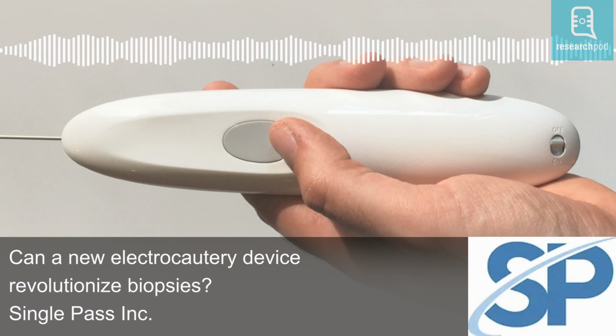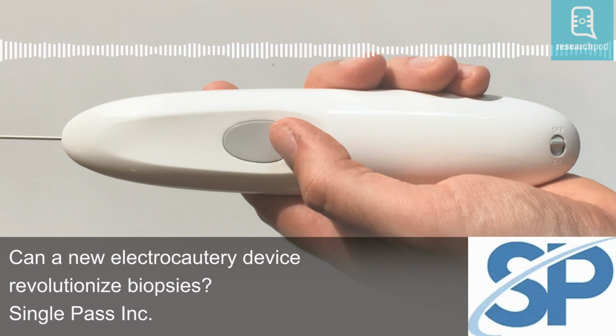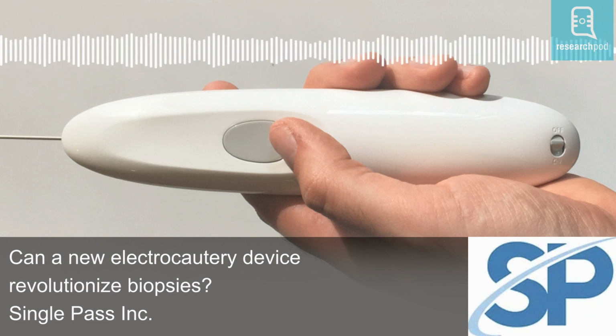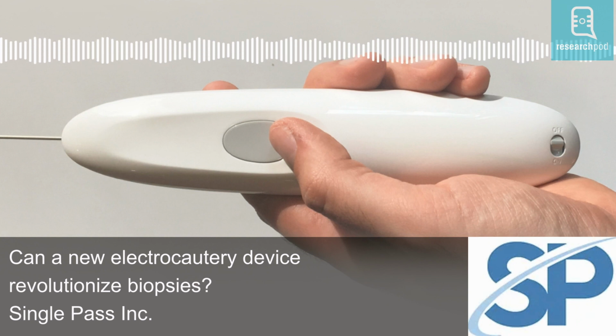In addition, this makes biopsy procedures safer for higher-risk patients who are on anticoagulants, which make them more prone to bleeding. This gives surgeons a high amount of control while also making biopsy procedures safer. Biopsies are important procedures despite their risks, so it's beneficial to be able to reduce anxiety on both patients and surgeons.